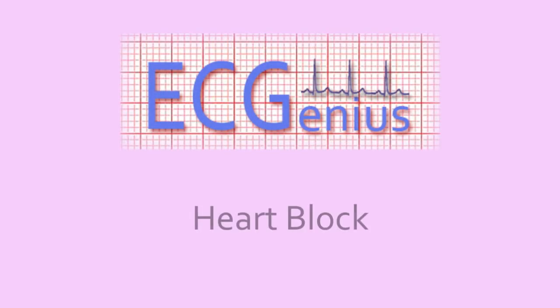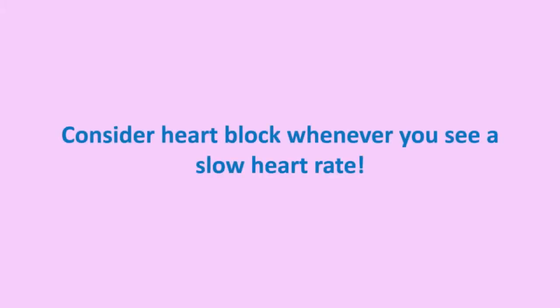Welcome back to ECGenius. In today's lesson, we'll be talking about heart block. You should consider looking into the possibility of heart block in any patient who presents with a slow heart rate or bradycardia.